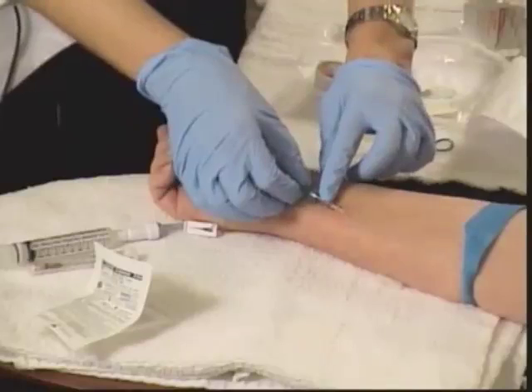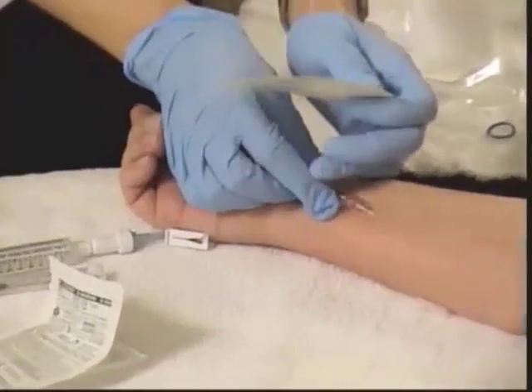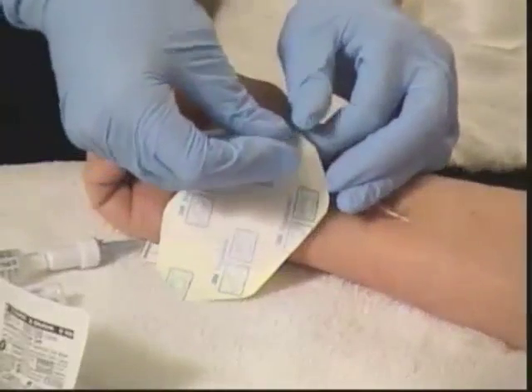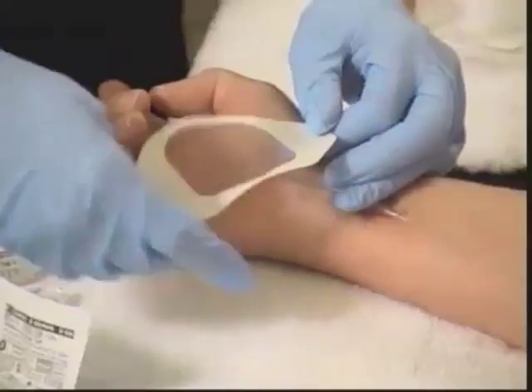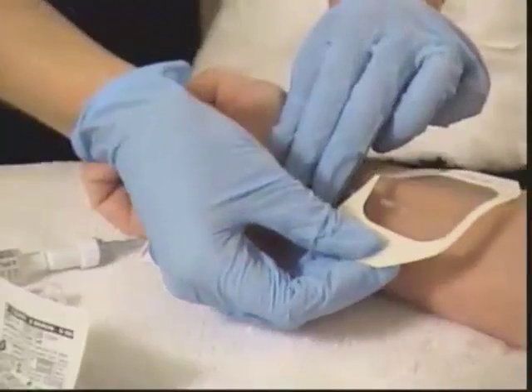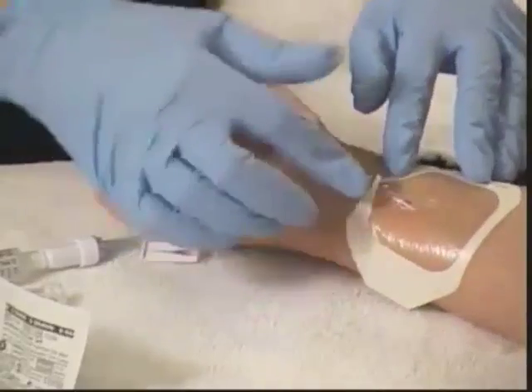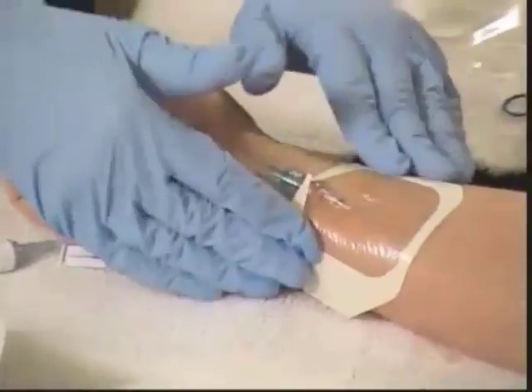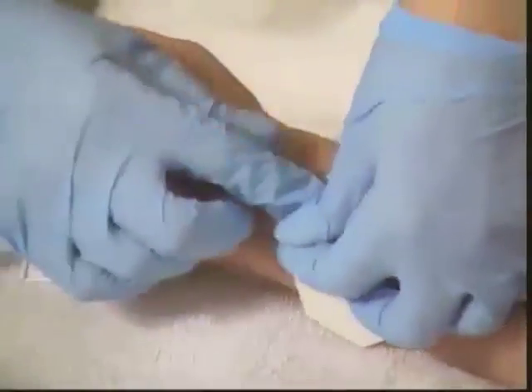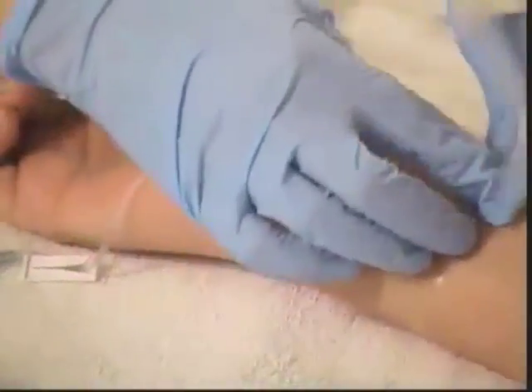We want the resident to stay still while we apply the transparent dressing. Take your Tegaderm or transparent dressing and apply it right over the top, with the insertion site in the middle. You want it to go right up to where this luer locks to the extension tubing. Press it down firmly as you go, then remove the outer frame portion of the dressing.